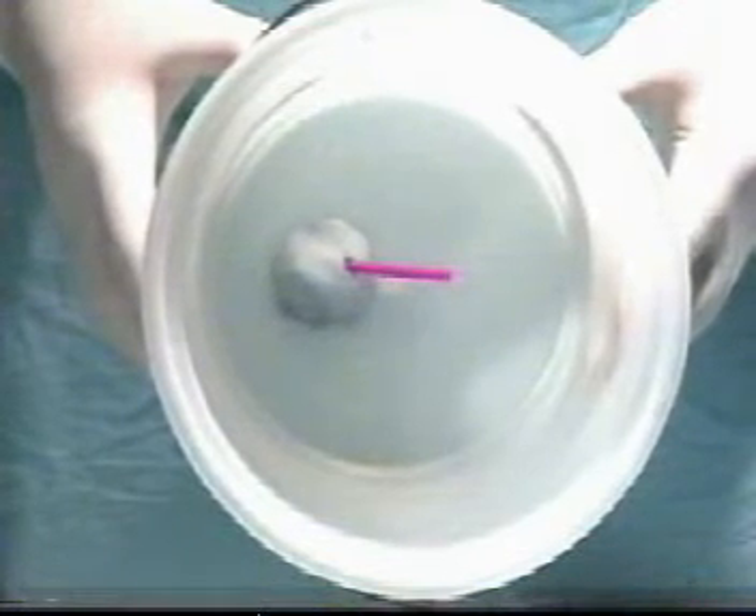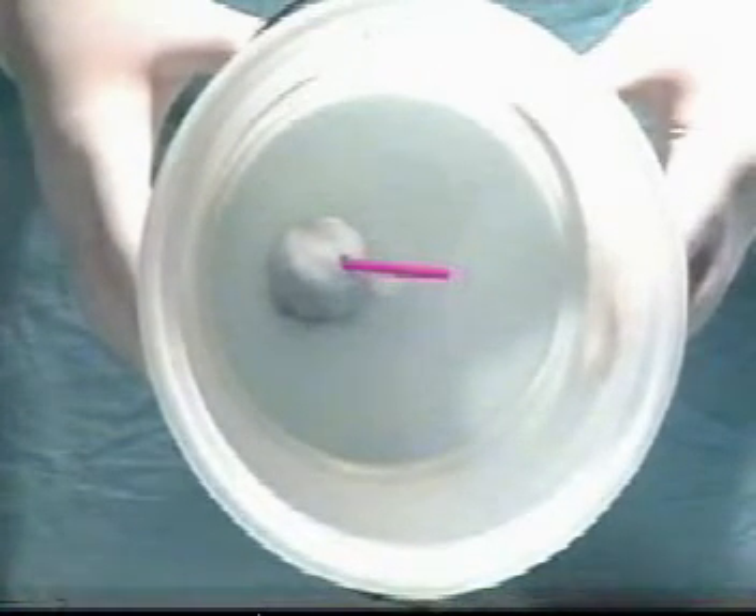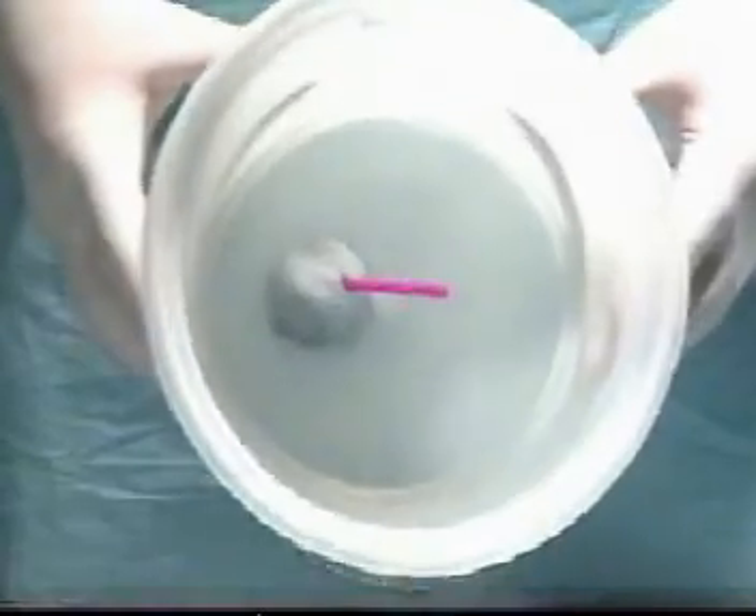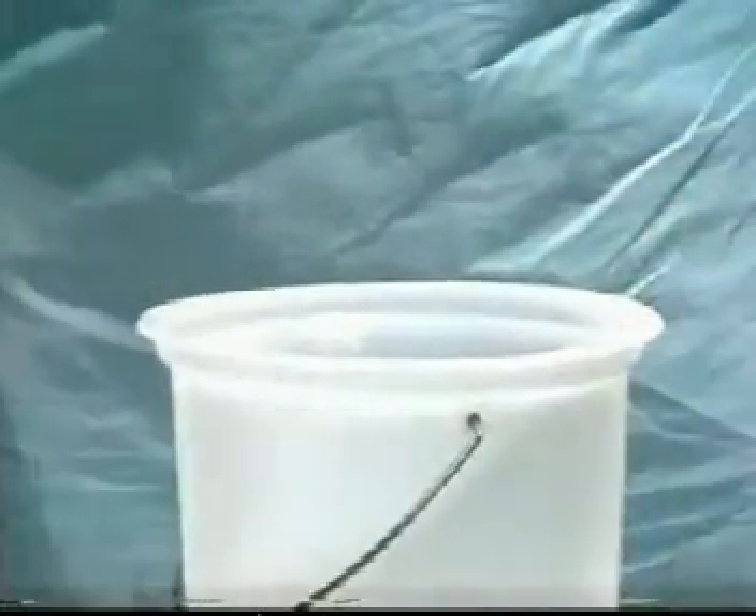Let's look at a model for tying at depth in the pelvis. You see here a simulation of a small blood vessel deep in the pelvis, made from a straw and a blob of blu-tack.